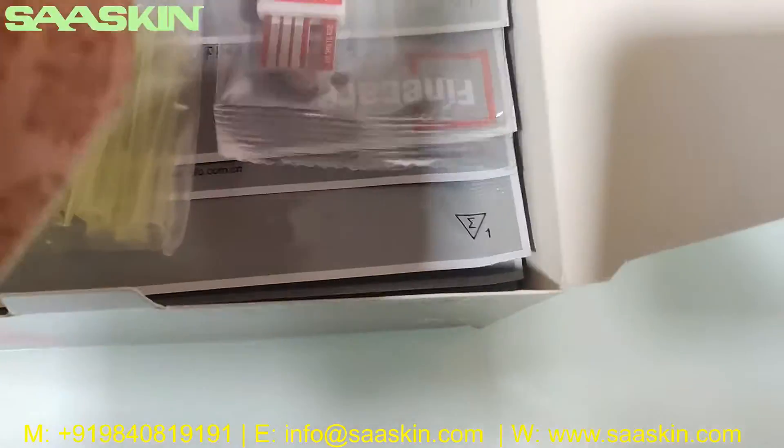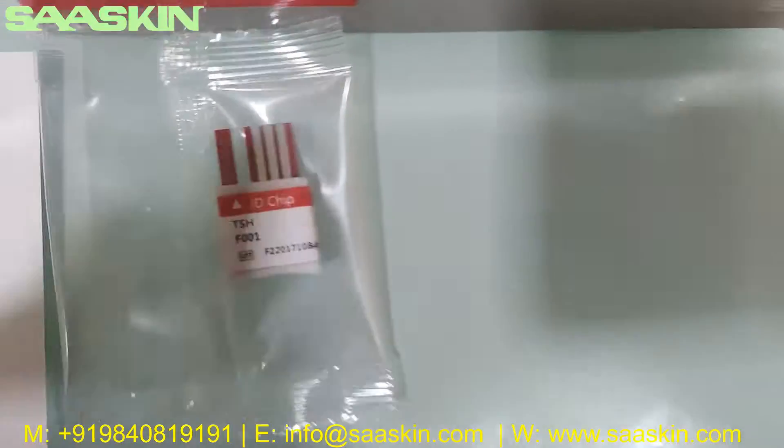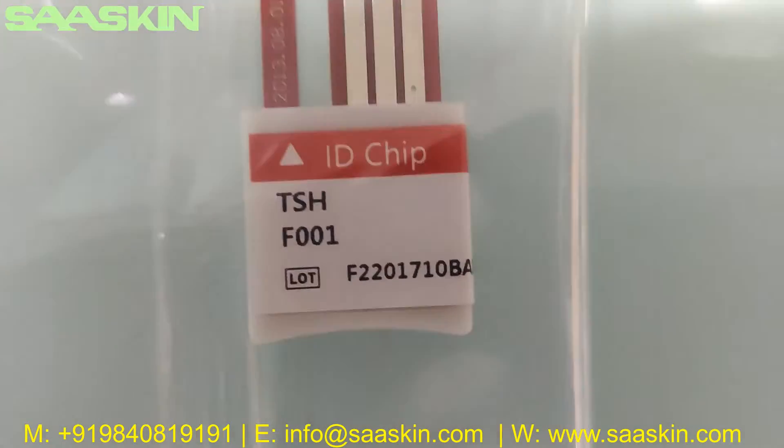Going further inside, we can see one ID chip. On the ID chip, you can see the test type written on it, and also the lot number.